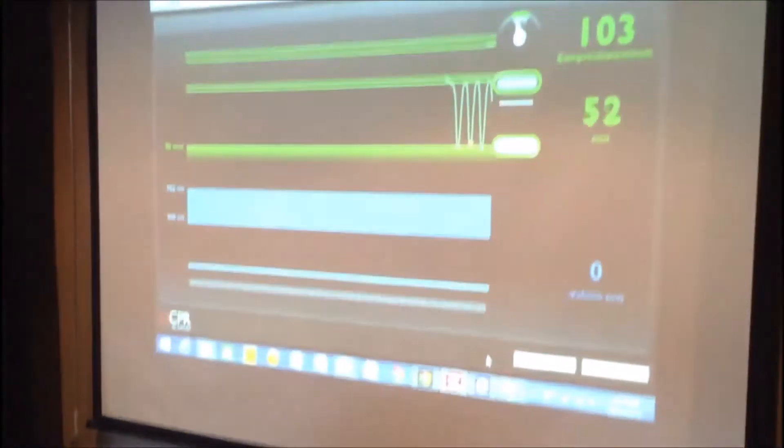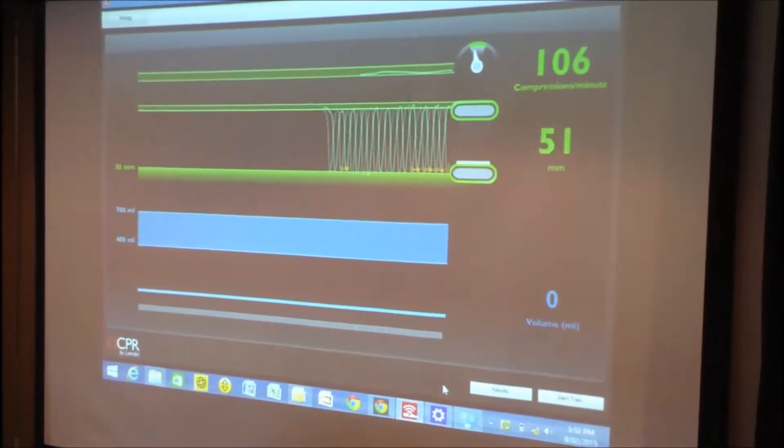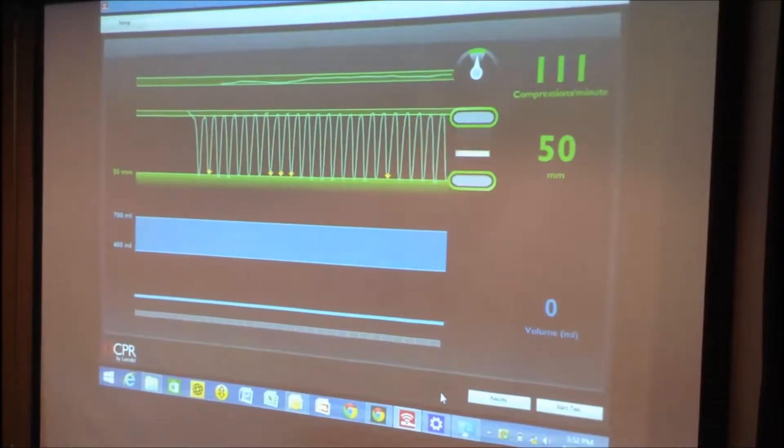So what we can see here is every compression and every release is being measured. In the top right corner we have our rate counter, and then below that we have our average depth as well. I'll begin to make some deliberate errors.